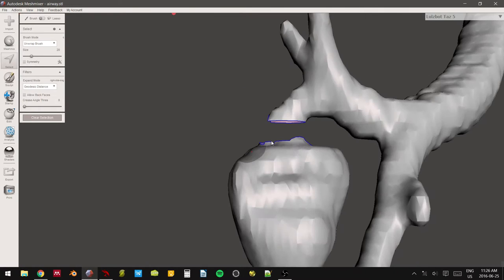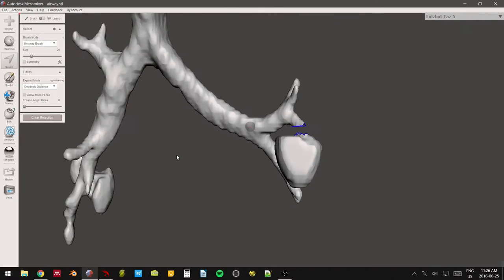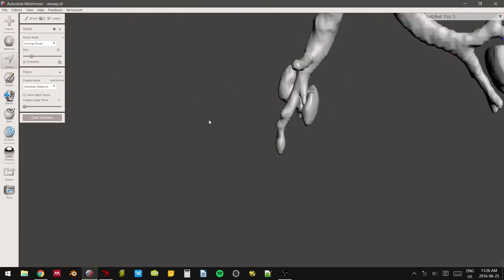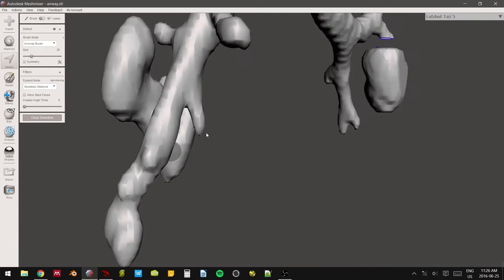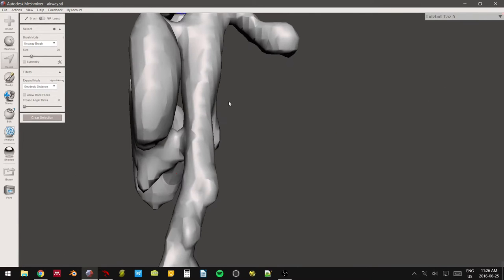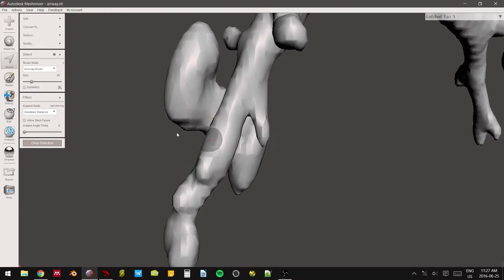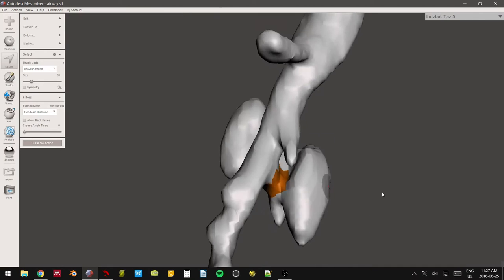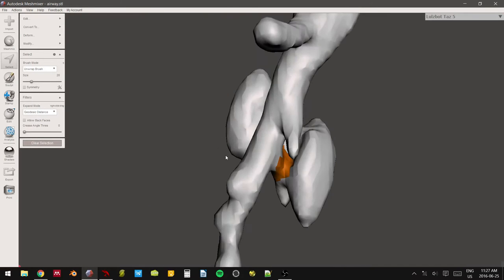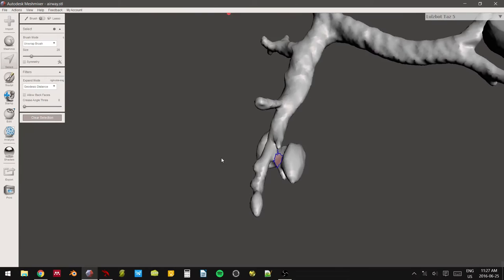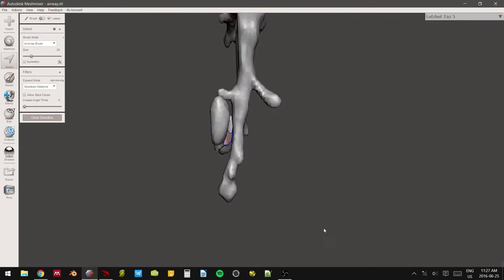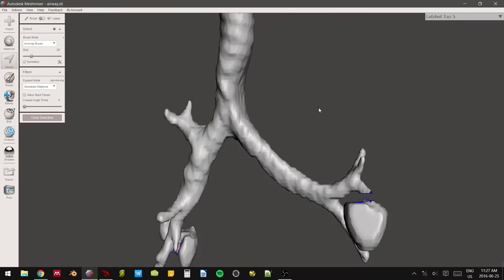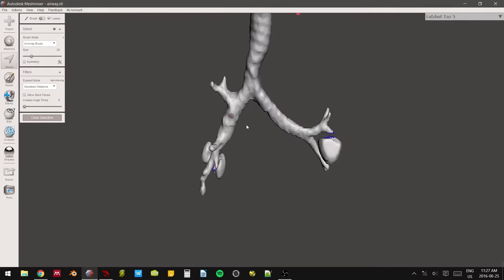So now those two are completely separate from each other. We're going to do that for all the extraneous features that we picked up along the way during segmentation. Again, go right lower. We're going to separate this out. If you want to be more careful and select those smaller brush sizes, it'll still be okay. Okay. We're going to hit delete.